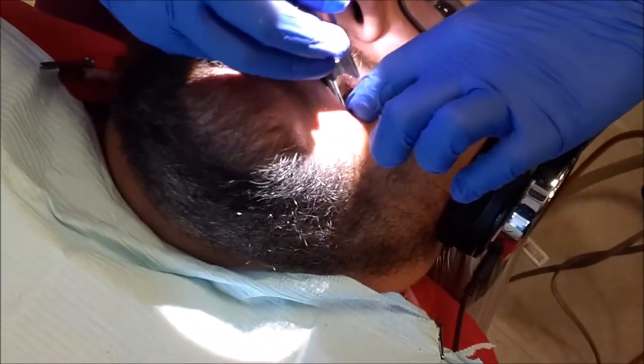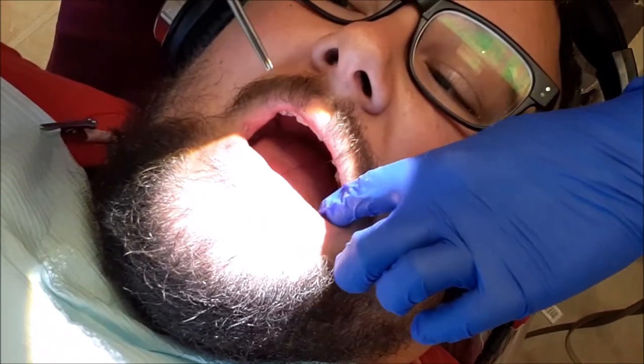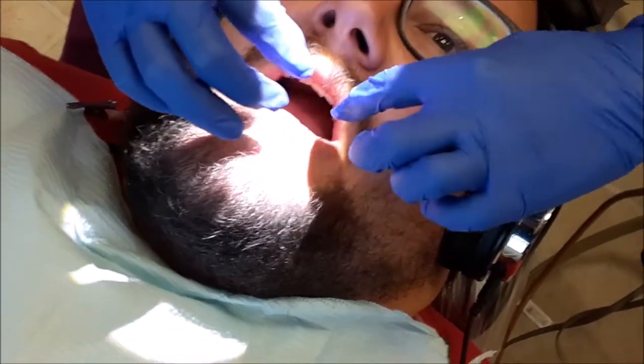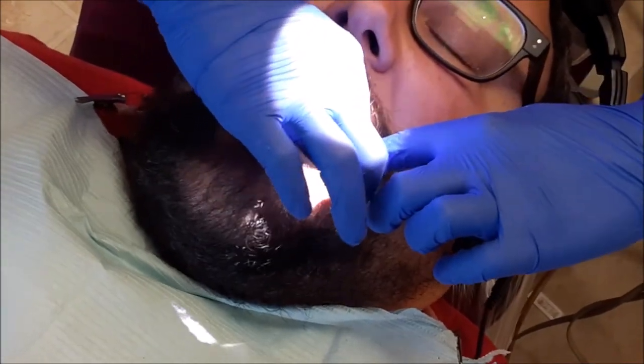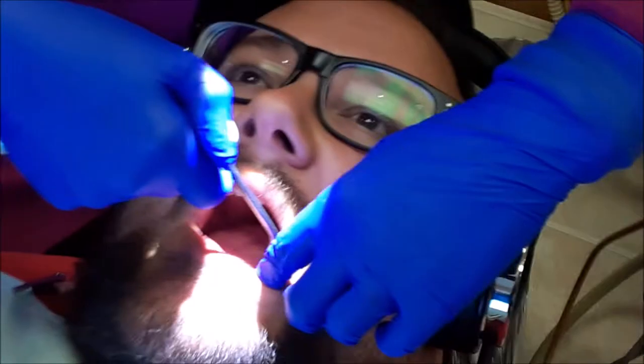Down and kind of tap, tap, tap, grind around. And open. How's that feel to your bite? Good. It's not hitting against anything on top, though, because you don't have a tooth on top, right? He has one little area that kind of where it kind of touches. There's going to be a lot of air.